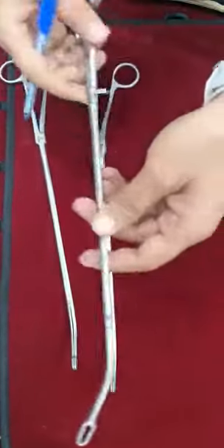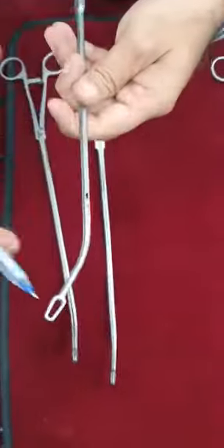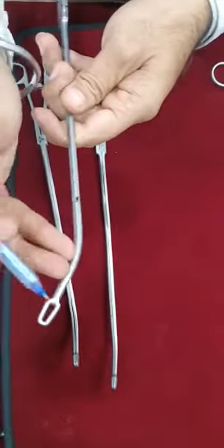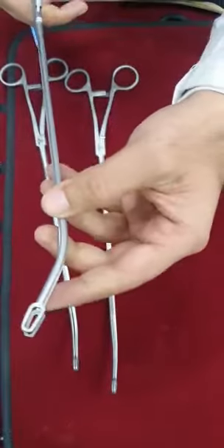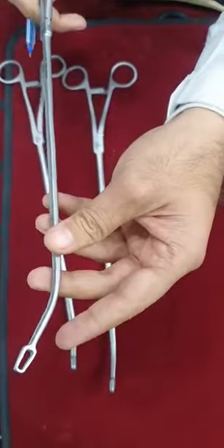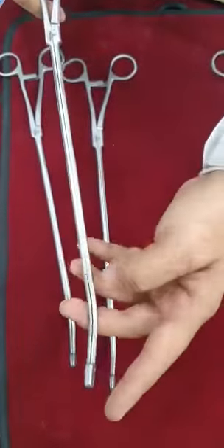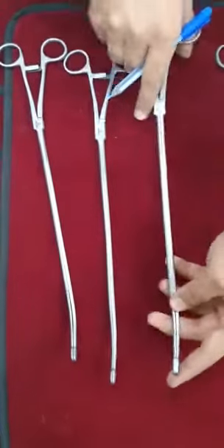Then we are having this snake dissector. This is triangular in shape, V shape. I hope you will appreciate the teeth of this snake dissector. Once again it is in 5 mm; 13 and a half inch is the length of the instrument.